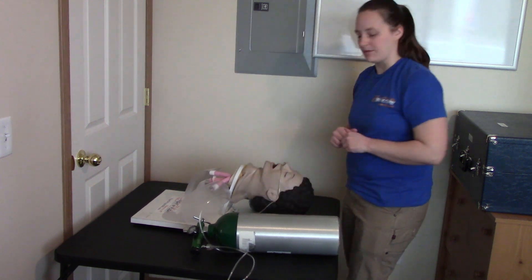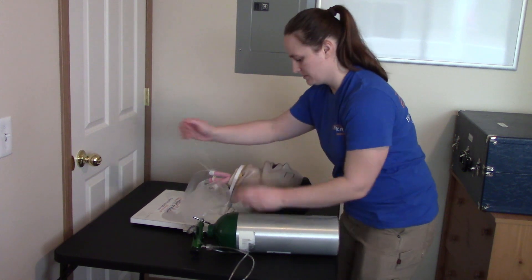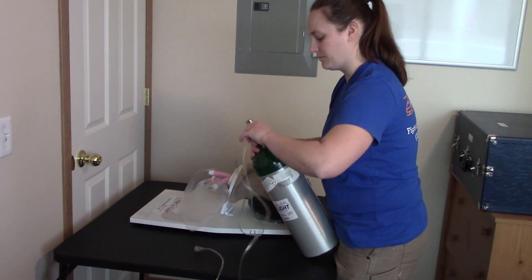At this point, the examiner will tell me to discontinue oxygen therapy, so I will remove the nasal cannula and discontinue the flow of oxygen from the regulator.